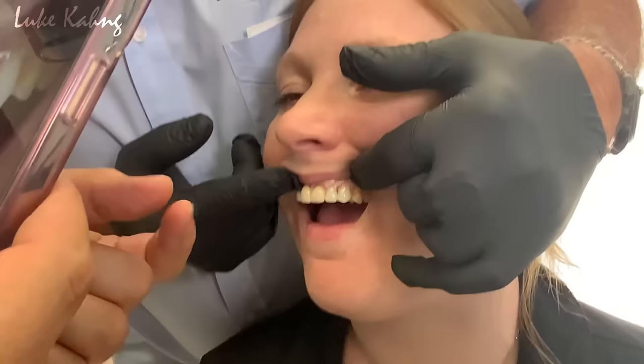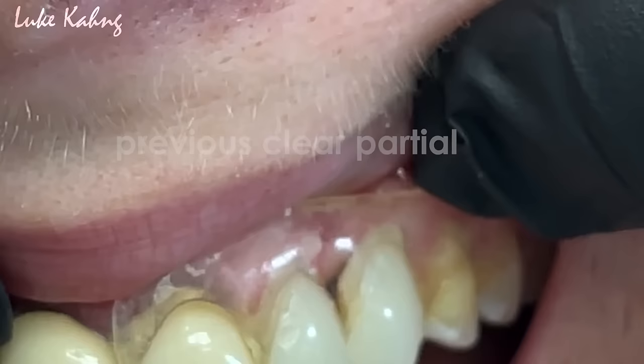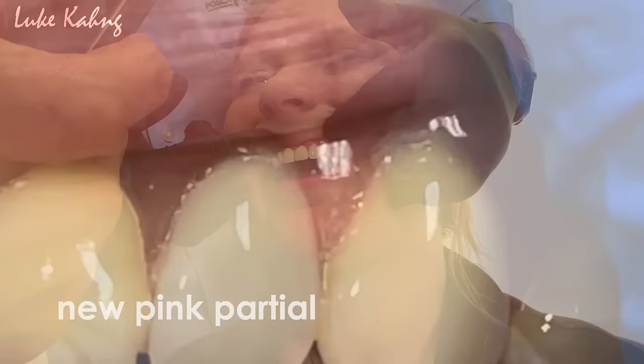Now put it back to where the new one is. Some of the dentists are questioning whether they have to make the clear or the pink color. So we all the time make the pink color, it is better. That's the final. All right, thank you.